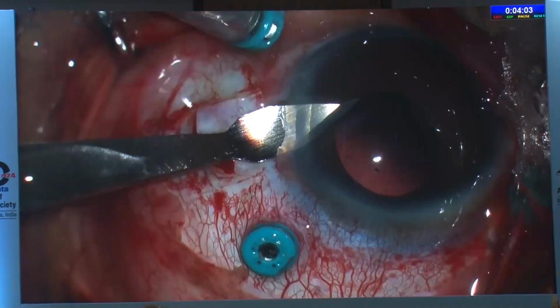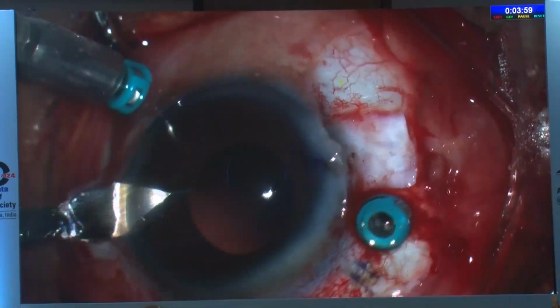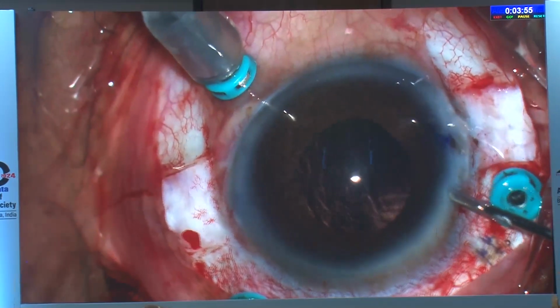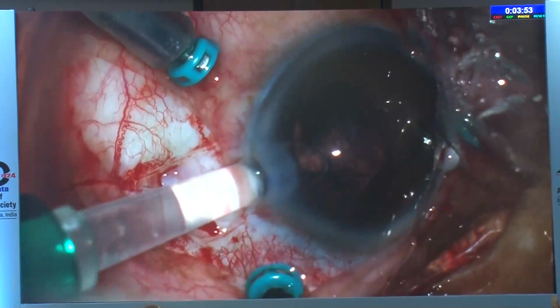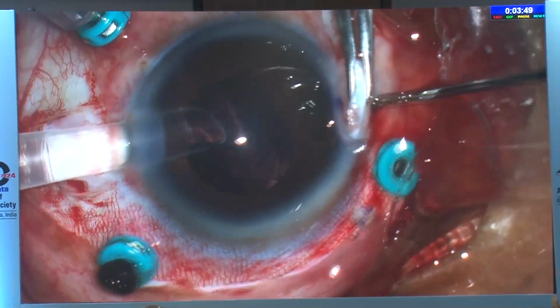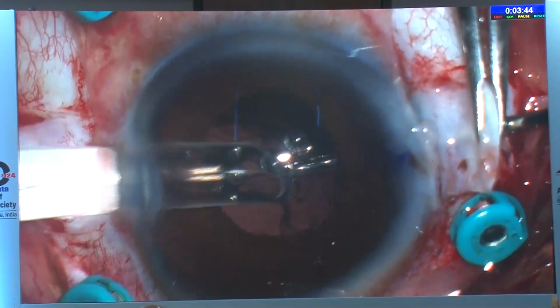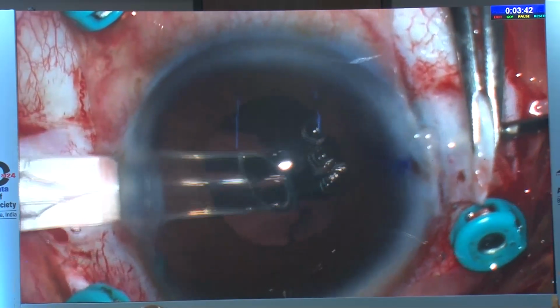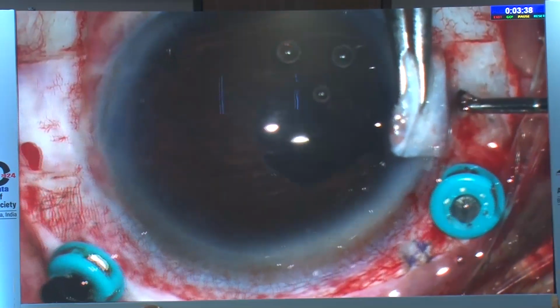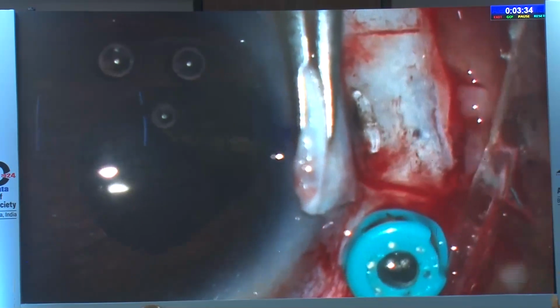Another technique which we thought would be more convenient or easier is, rather than going superiorly with your entry, this time I went temporally, so that as soon as I inject, I am ready with the other forceps to hold it. As 90 degrees is opposite, it is easier to hold and you just bring it out.